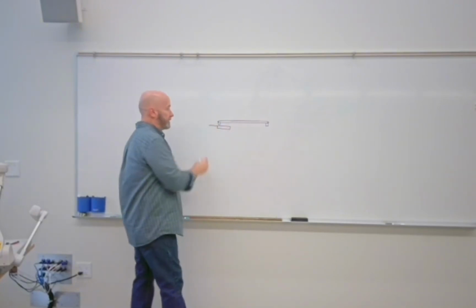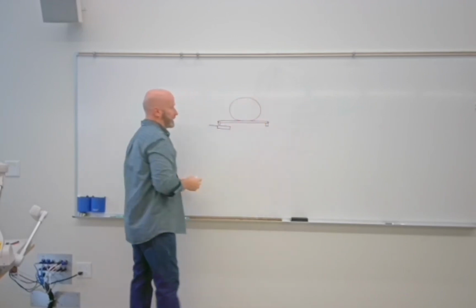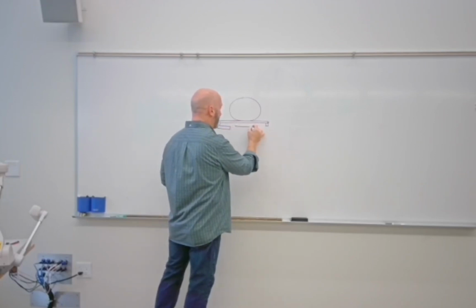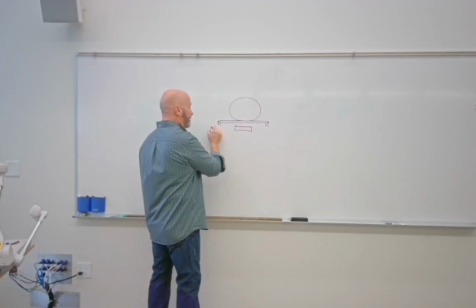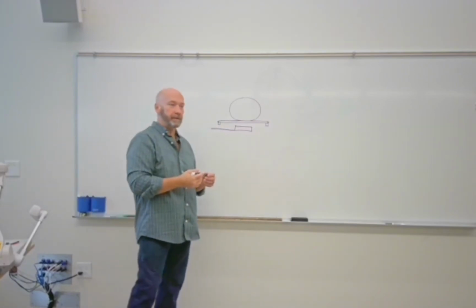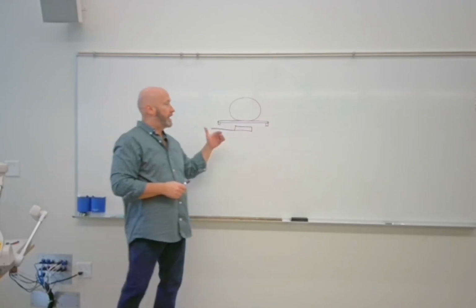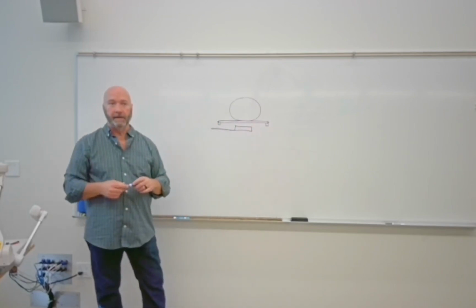The Bucky is pulled out, we push the image receptor in, we'll put the patient here, and we've got a pretty round patient there. Then what do I have once I push this thing in and my image receptor is there? What do I have naturally that could be an imaging problem here? OID, increased OID, right. So with the supports on the bottom, you have a natural increase in OID, okay?